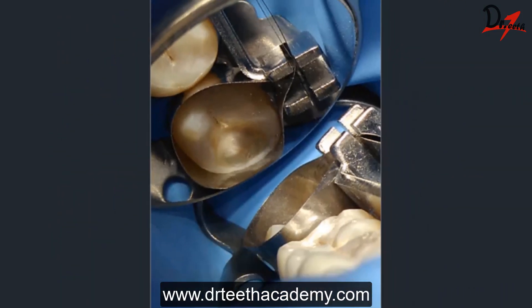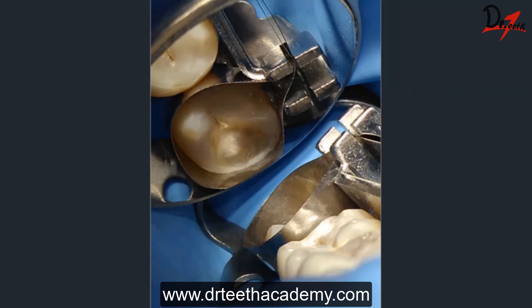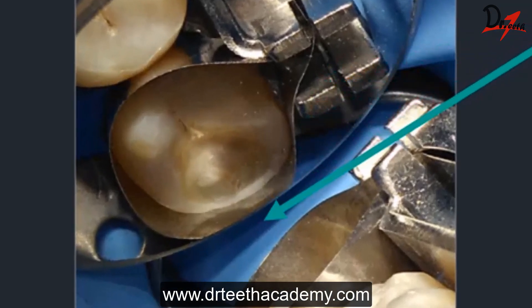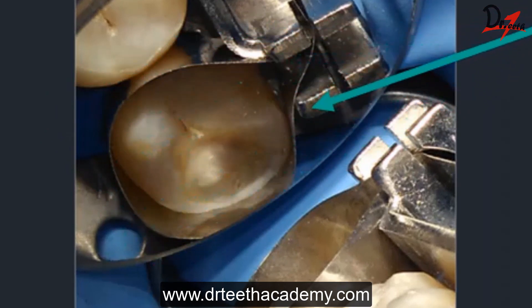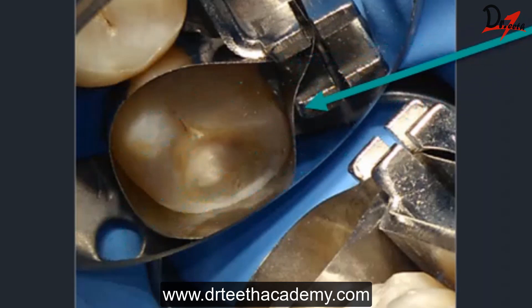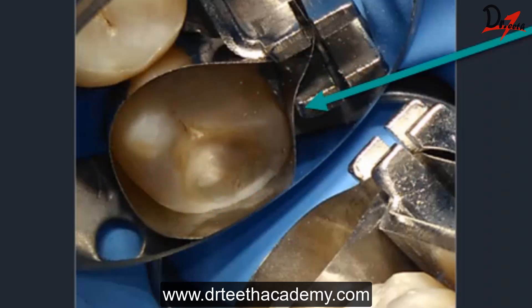The next step was matrix placement. As this is a Class 2 restoration, I need to use a matrix, so I went ahead with the regular Toffelmire matrix. As you can see, I have adapted my Toffelmire properly. Adaptation of the Toffelmire can be really tricky, and there are a lot of questions around it in dental practice.